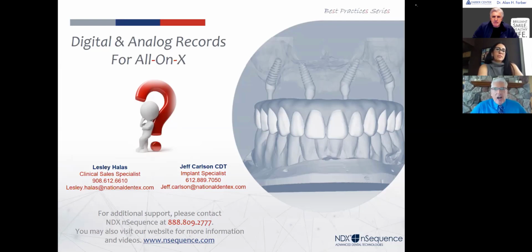Dr. Fazio, I don't think so. I'm not an expert on the scanning part of it, quite honestly. But I do know that the technology has developed, and for a brand new unit, I have a friend that works with another company, and talking with them, they seem to have worked out a lot of those issues. For us, going millimeter by millimeter is to find artifacts or inconsistencies, because for us it's about connecting the dots, because we're making our foundation guide that is going to fit buccally as well as lingually or palatally onto the bone. So we're looking to get as much information as possible. I don't think there's going to be any issues or concerns. I know Planmeca is one of them that we do get a lot of. I do know we get a lot of scans from people using Planmeca.